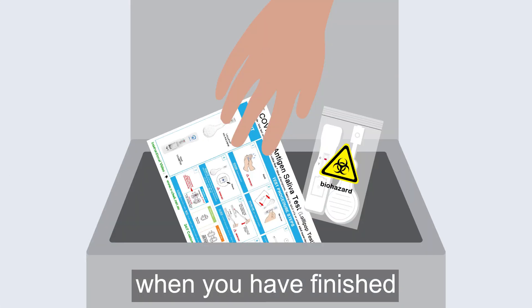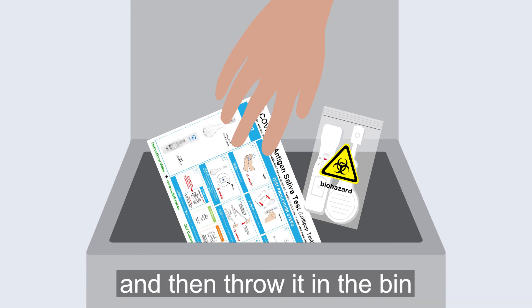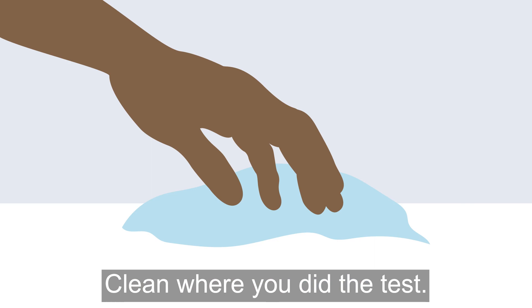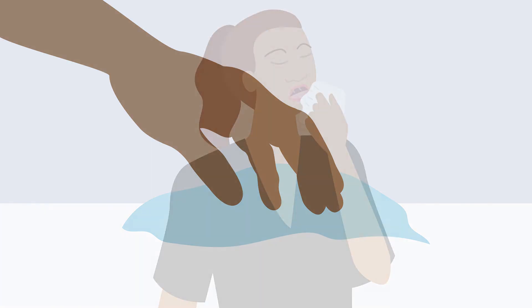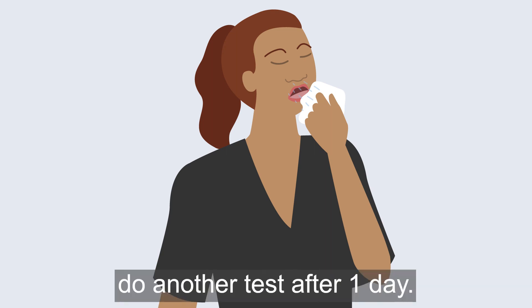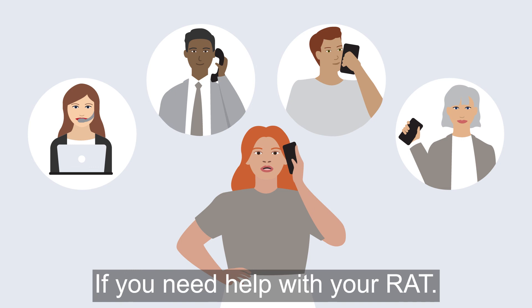When you have finished, put everything in the little rubbish bag and then throw it in the bin. Wash your hands and clean where you did the test. If your test was negative but you still think you have COVID-19, do another test after one day. Talk to someone you trust if you need help with your RAT.